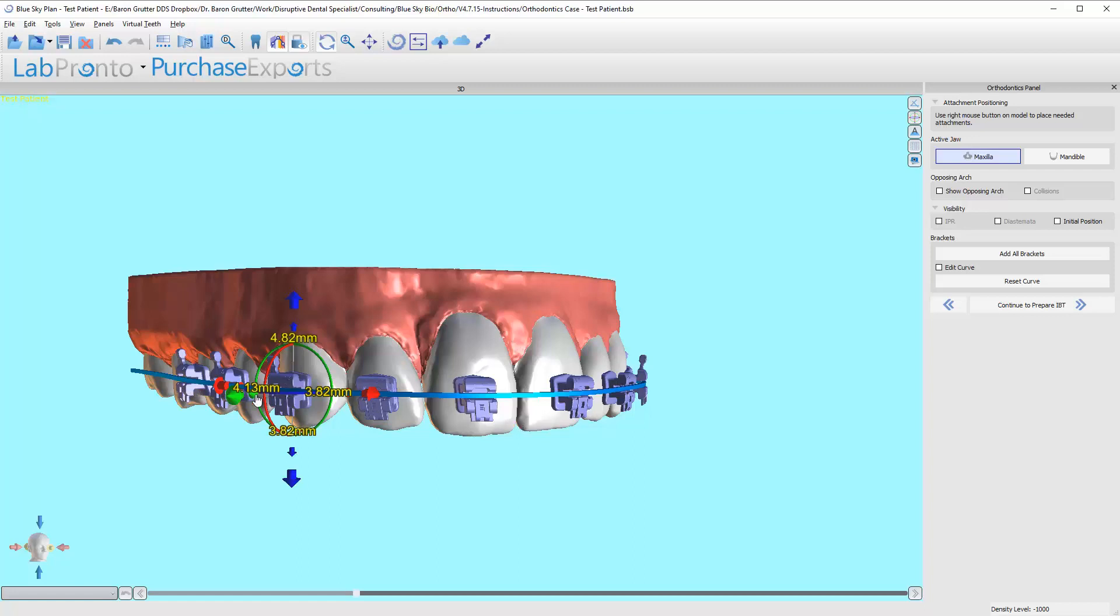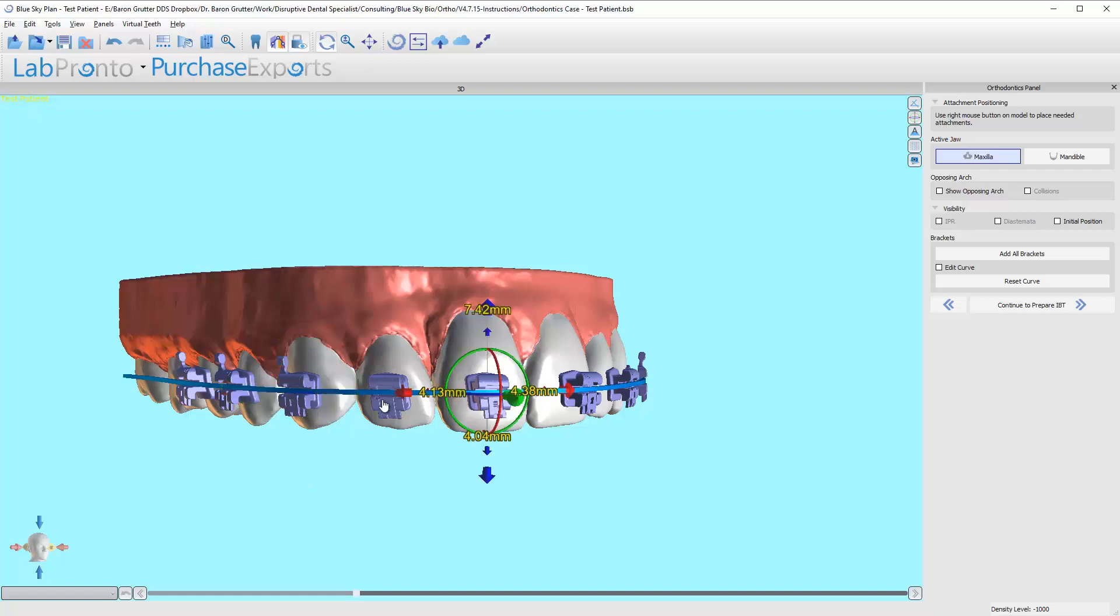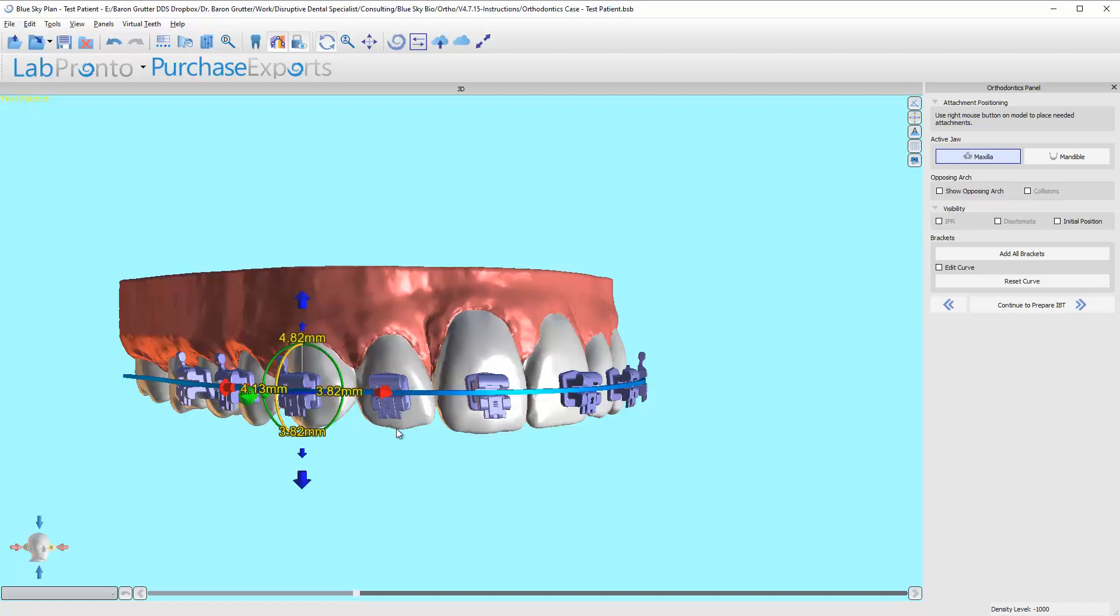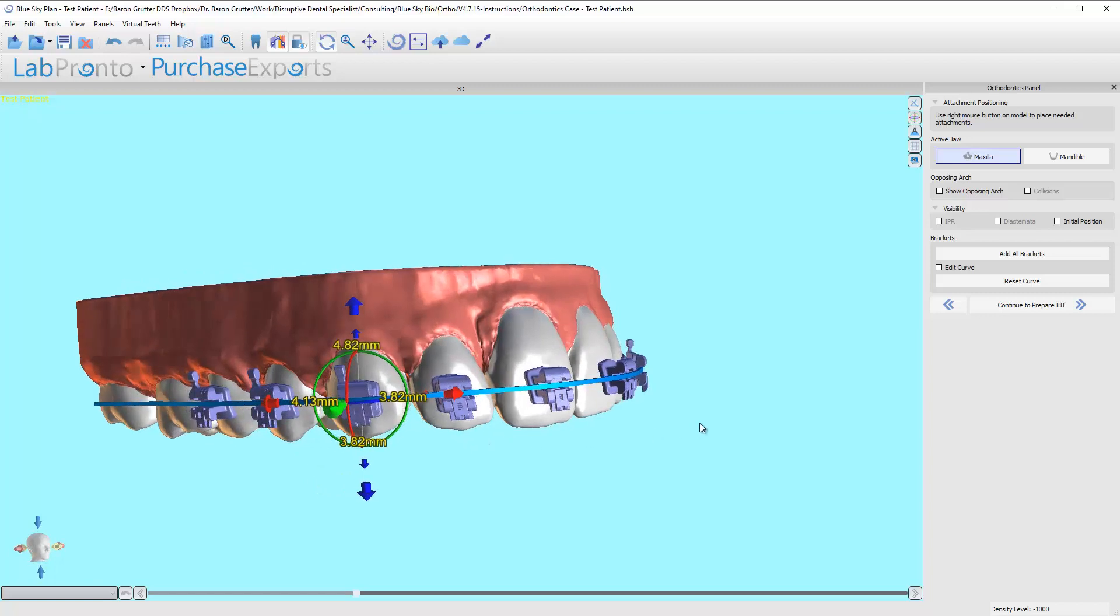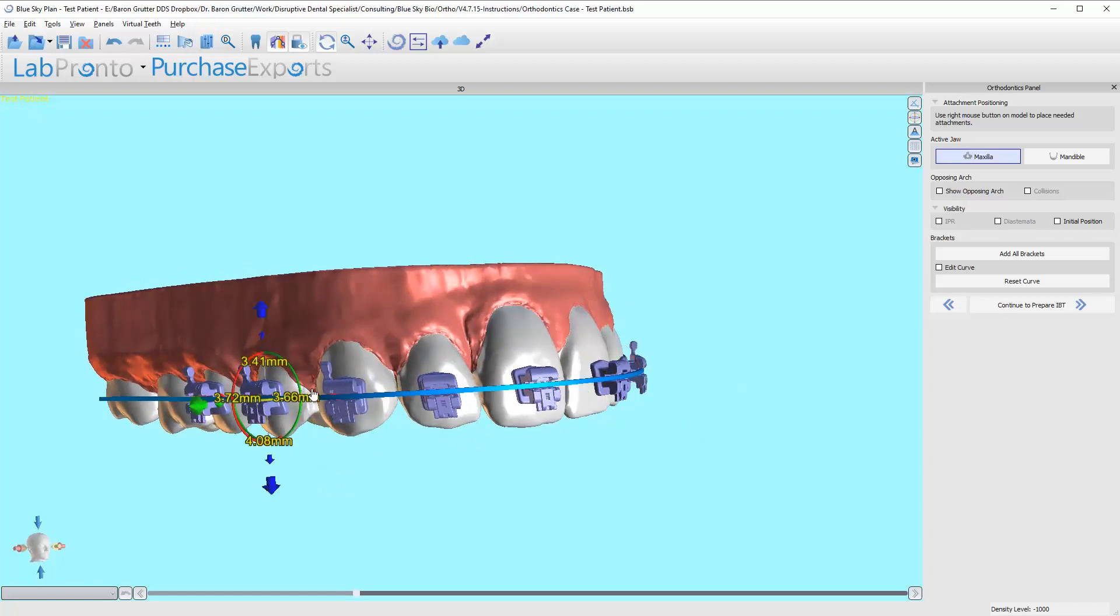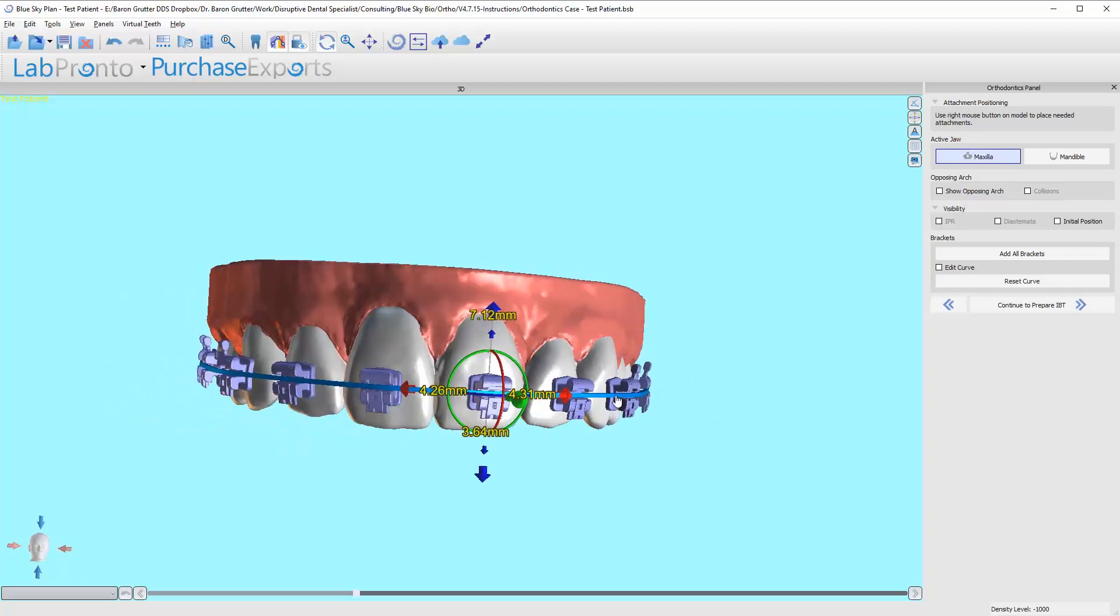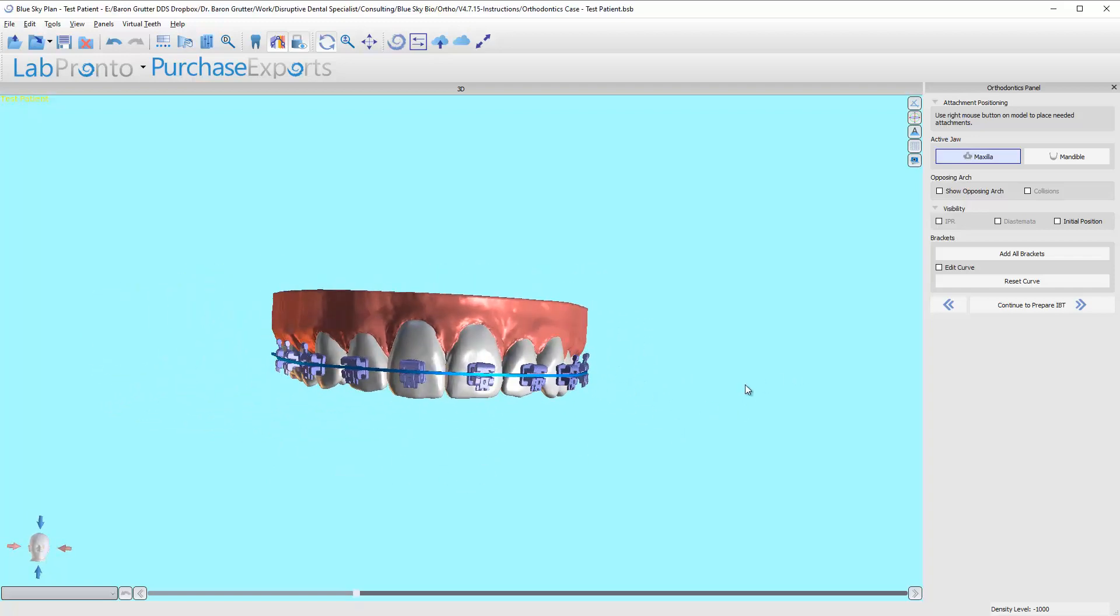But again, those measurements, although they might look weird to you, they might not be what you're normally used to, it doesn't matter because they're all relative to each other being straightened out on this rectangular wire. So there is no four and a half millimeters, four millimeters, four and a half, or five millimeters, three and a half, three, whatever. Those are sort of the traditional measurements we don't need for this approach because, I keep repeating myself, the brackets are all aligned relative to one another so that the teeth end up in the position that we want them to line up in.